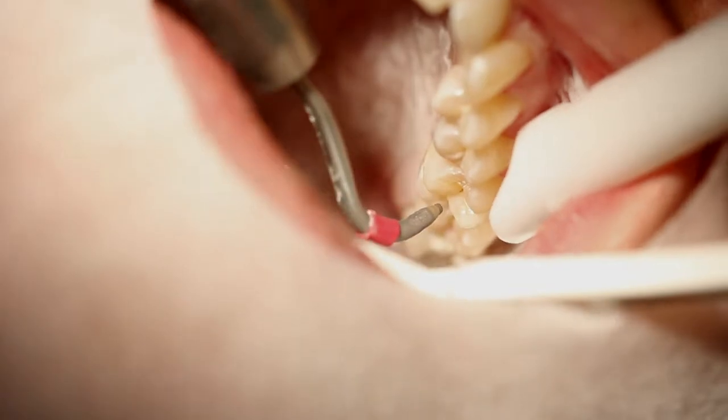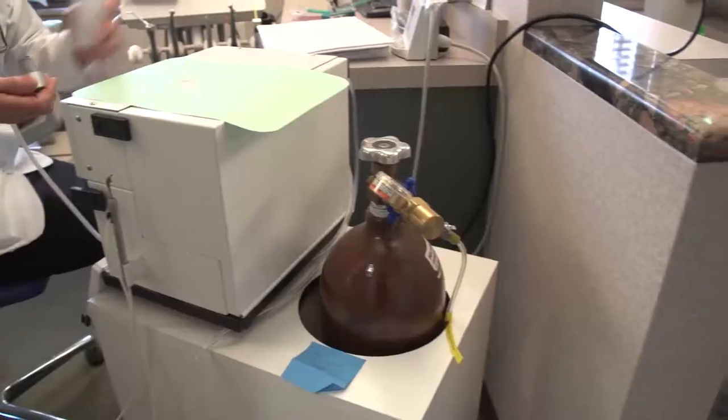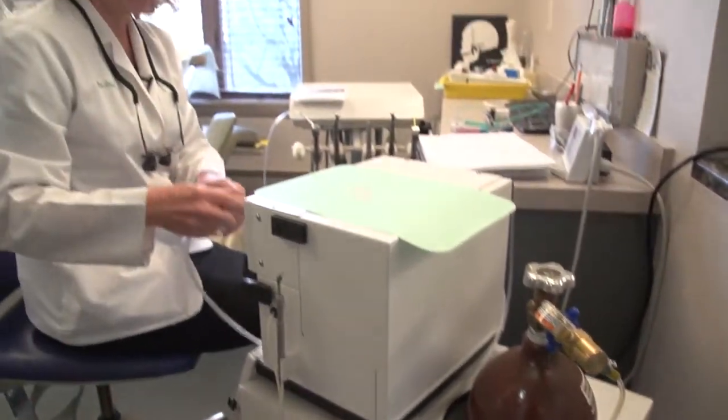If you catch it early, and instead of using a drill, you use a micro-sandblaster — which is called micro-abrasion — then you can do a restoration that will last a lifetime. Micro-sandblasting is really good in dentistry. It's a good tool. It's good for people because you can do minimally invasive dentistry with it.